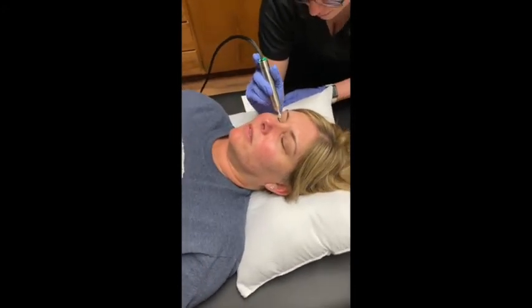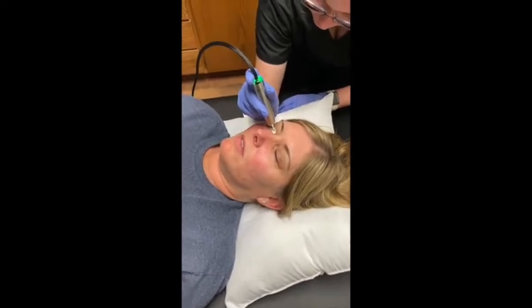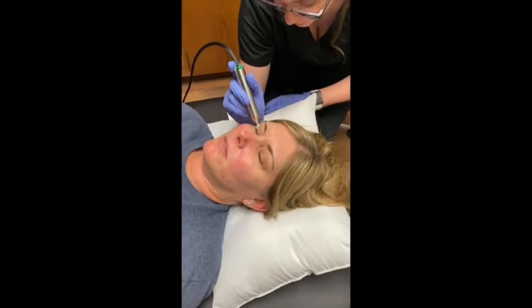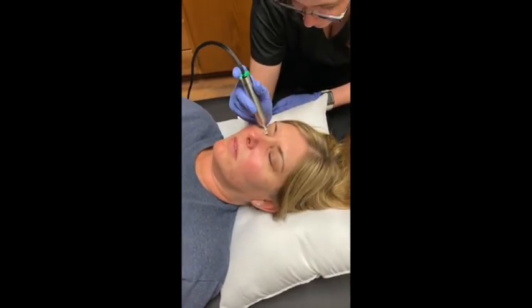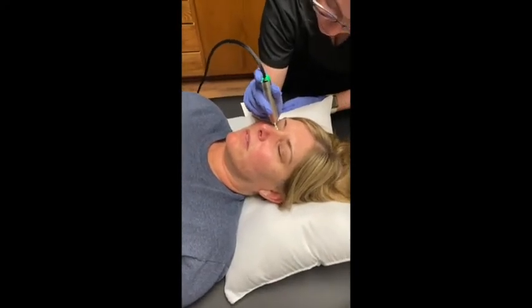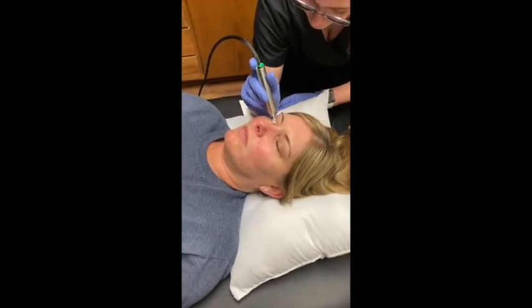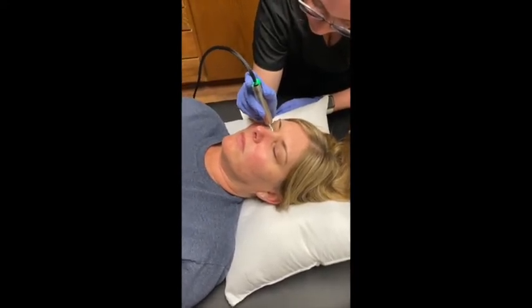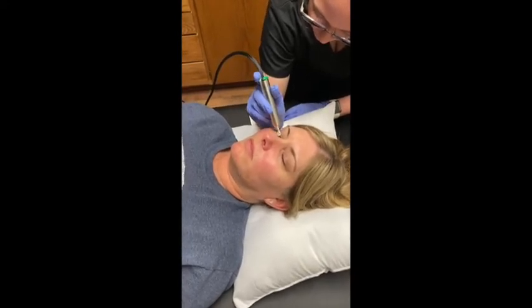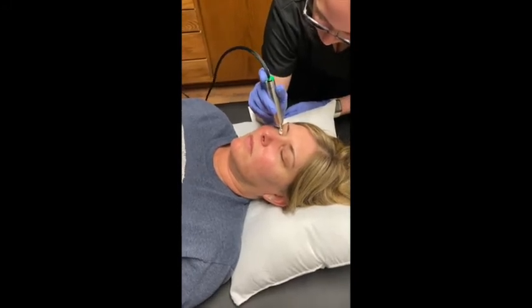Right. And how did it feel after the first treatment? A world of difference. Okay. How long did that last? About a week. Okay. And then you had the second treatment, and how long did that one last feeling good? About 2 weeks. Okay. And so after this third one, normally we get about 3 months worth of comfort and all that stuff out of it. It's not a one and done type treatment. We go about 3 months in between each one after you get this third treatment. And so hopefully we're getting that kind of distance out of it.